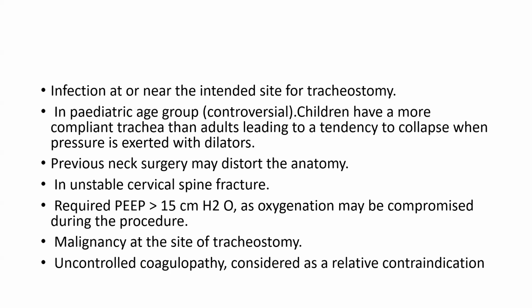In the pediatric age group, children have a more compliant trachea than adults, leading to a tendency to collapse when pressure is exerted with the dilator. Previous neck surgery may distort the anatomy. Other conditions are unstable cervical spine fracture, required PEEP of more than 15 as oxygenation may be compromised during the procedure, and malignancy at the site of tracheostomy. Uncontrolled coagulopathy is considered a relative contraindication.